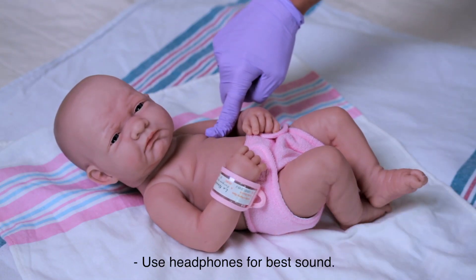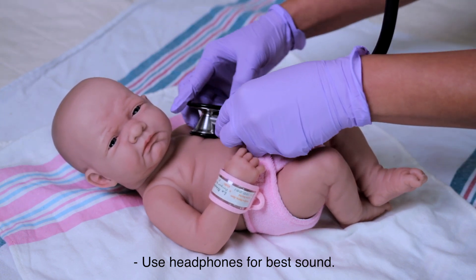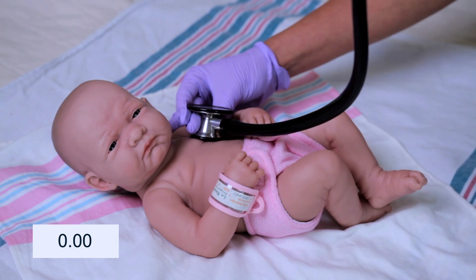This is where the apical pulse is. I'm going to add my stethoscope here, press firmly, and listen for one full minute.